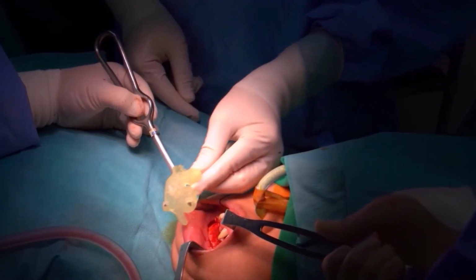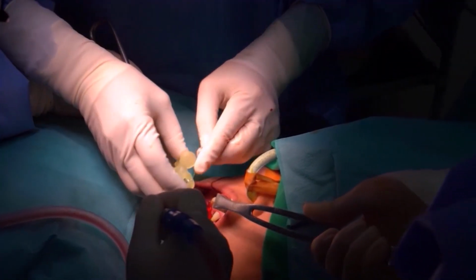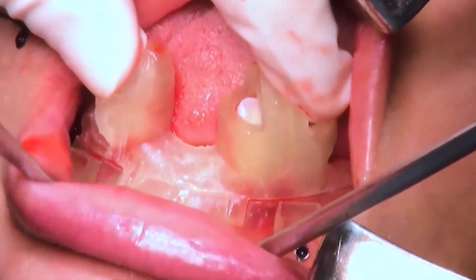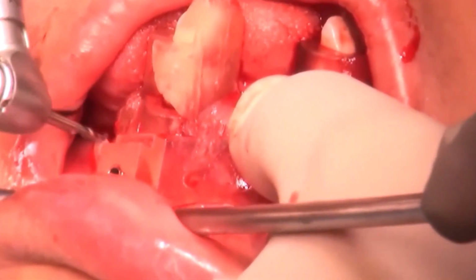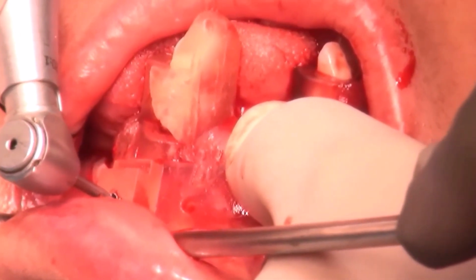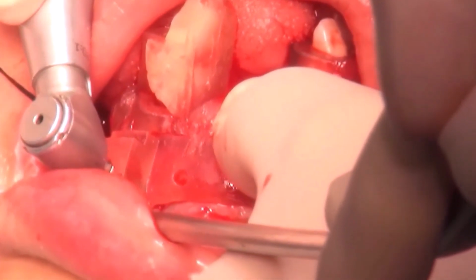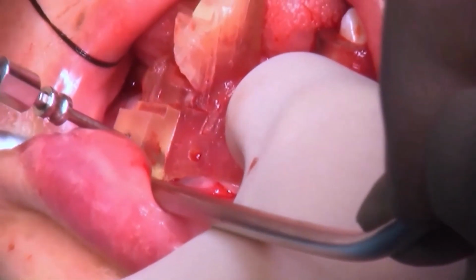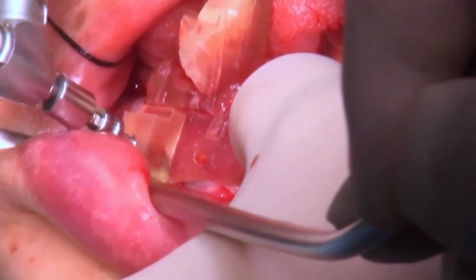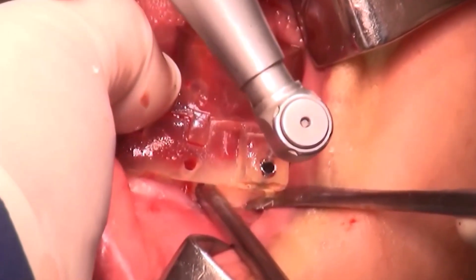The mandible is exposed on the labial side, and this is the bone reduction guide. The bone reduction guide is placed in the mouth. This is an anchor drill, with low-speed drilling without irrigation. An anchor screw is placed to fix the foundation part.